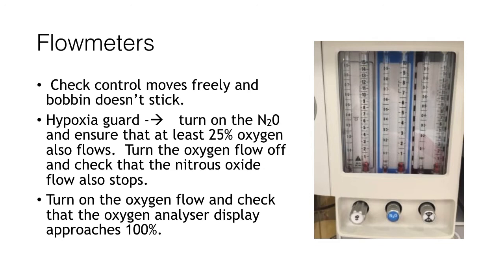We should also turn the oxygen flow to maximum and check that the oxygen analyzer displays that it is approaching 100%, ensuring that this is correctly working also.